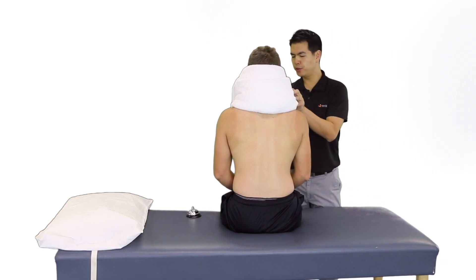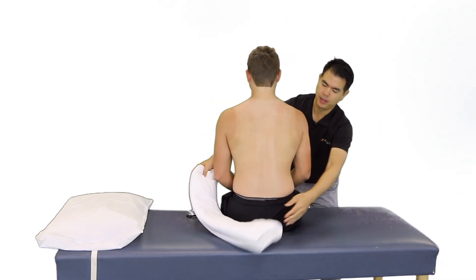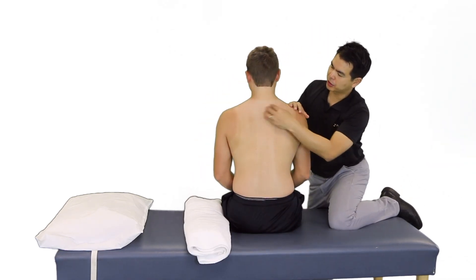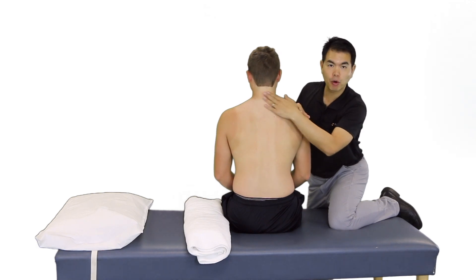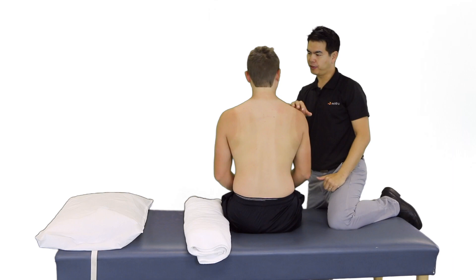We're now going to remove the hot pack and double-check how the patient's skin looks. It should be a little bit pink or red and warm to the touch, and we always want to check on patient comfort.